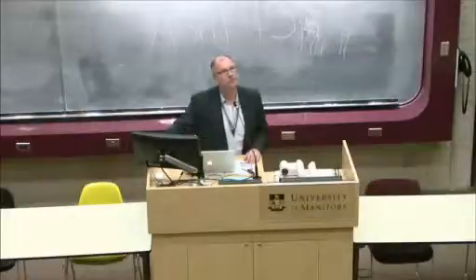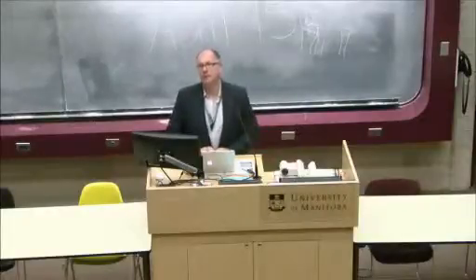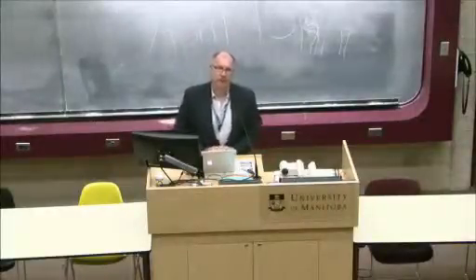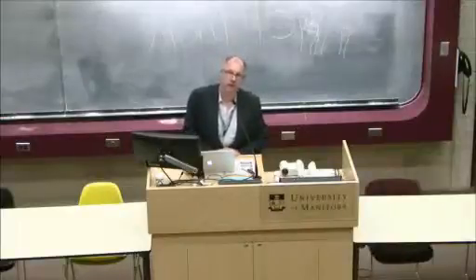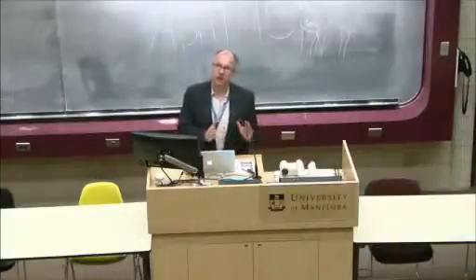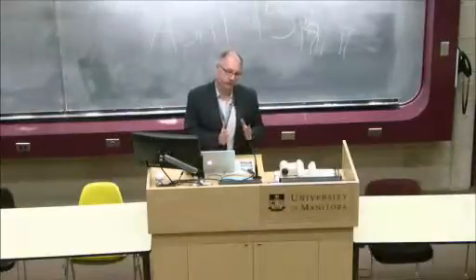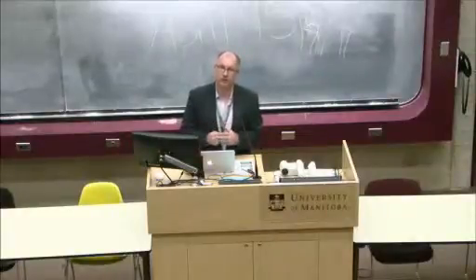Thanks, Dr. Essig. What about with PET MRI, can you use the MRI data, the anatomical data, to improve the quantitative analysis from PET? Yes, that's one of the topics that is currently investigated in a lot of PET MRI centers. Especially they are focusing on these early stages of neurodegeneration. First of all, to see long term, like in the initial workup, how much amyloid is there, and how is the amyloid changing over time, and is it really correlated to the volume loss?